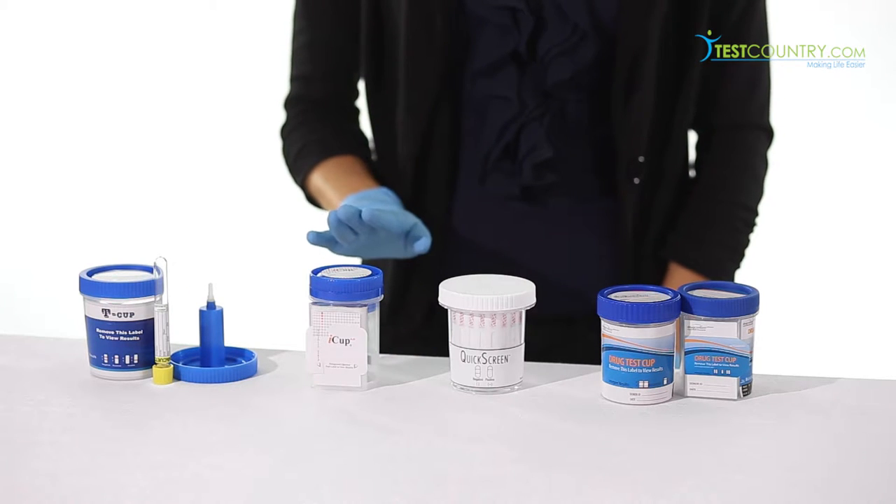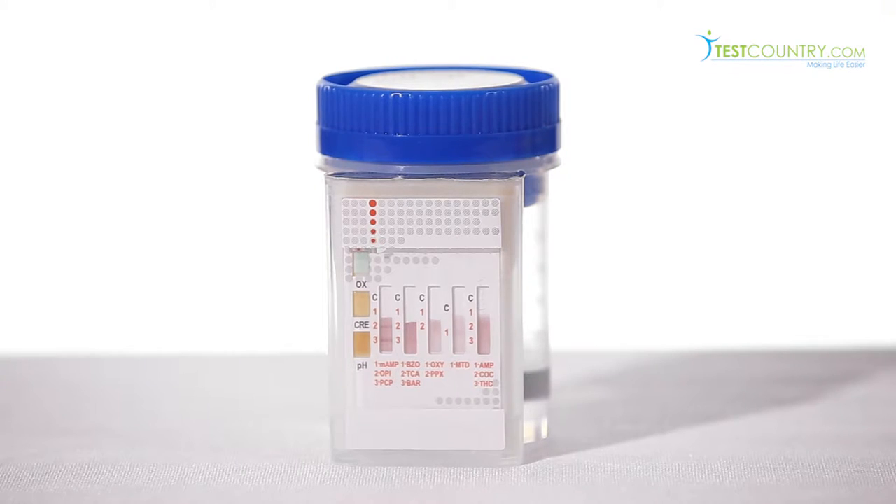The iCup can detect up to 12 different drugs, is FDA approved, and has excellent shelf life. The flat front of the iCup makes it easy to photocopy results.